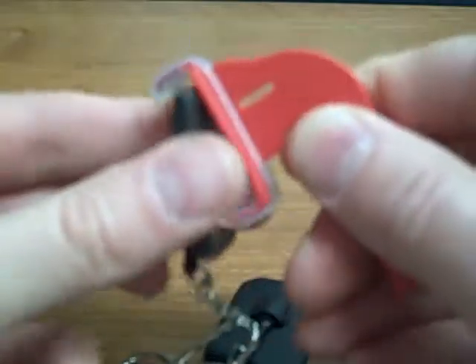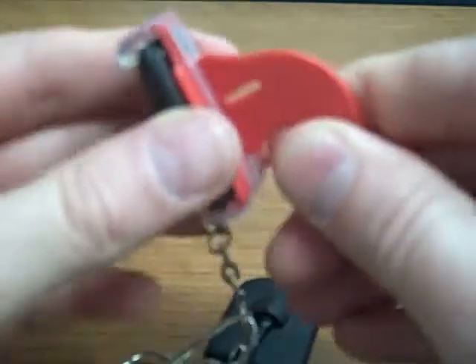The horizontal bite wing works very nicely with the size 1 and size 2. You can see I'm just using one bite block to hold both sizes.